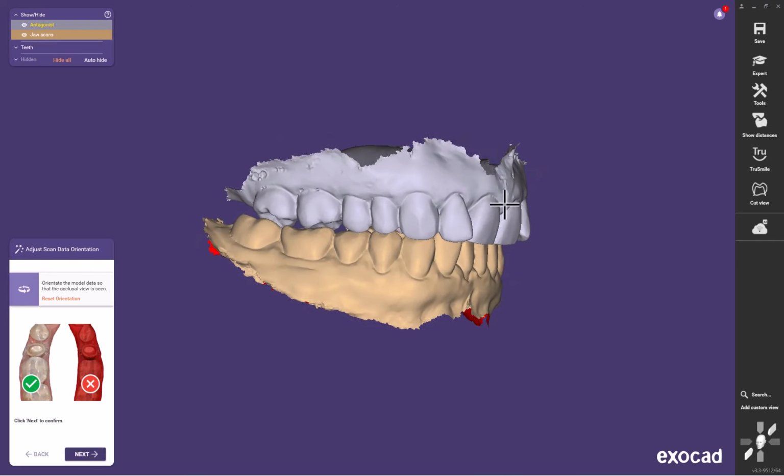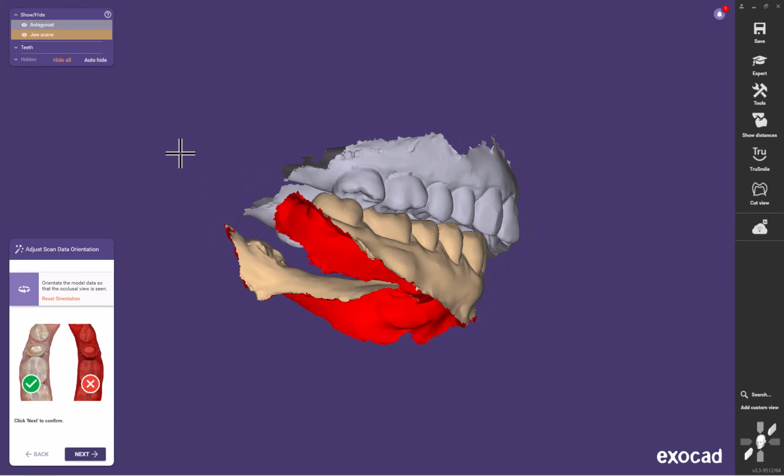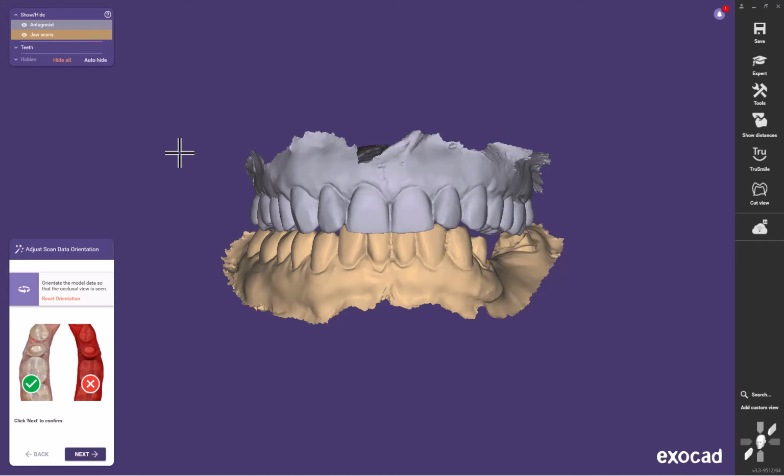and discomfort. Now, also mind you, I can load test this jaw as I hinge her in centric relation, and I apply pressure through the angles of the mandible up into the condylar area. She has no pain, tension, or tenderness in the condylar area as I'm applying that pressure. So that tells me the medial poles are intact and that I can proceed with restorative treatment, or I feel comfortable with that anyway. So here we go.